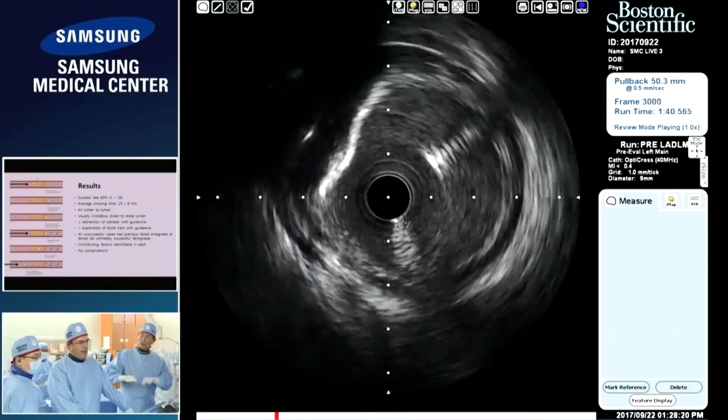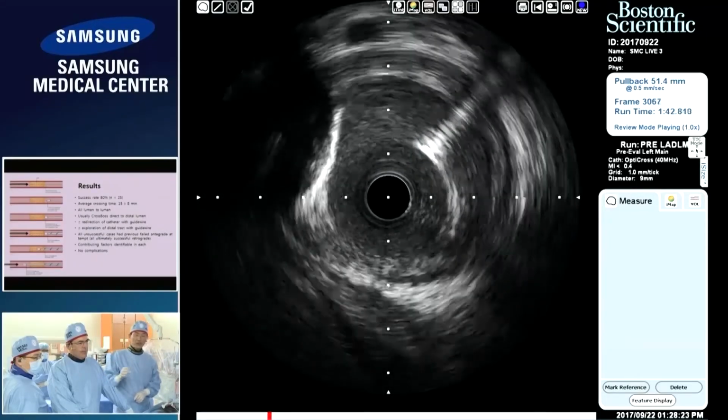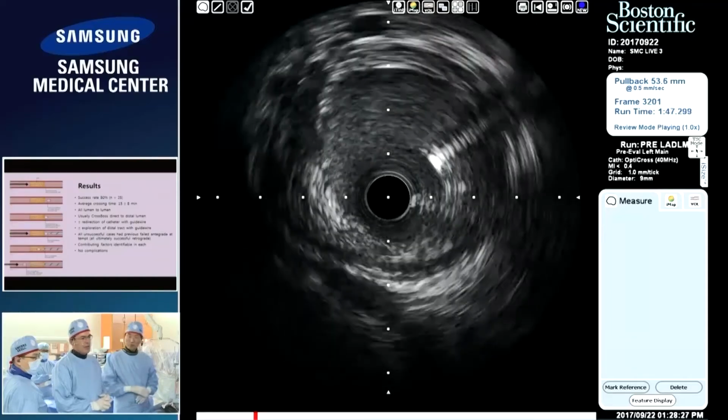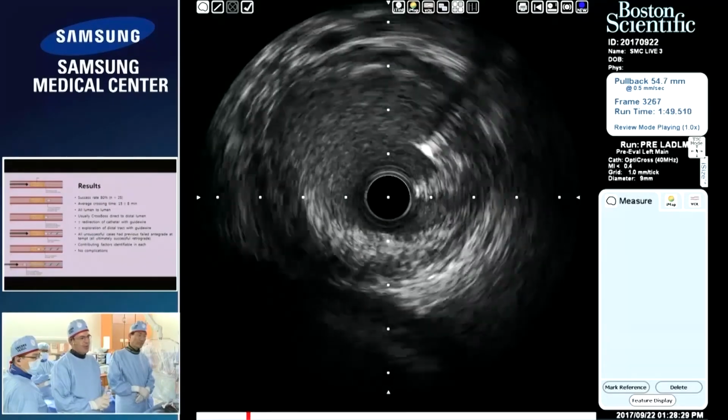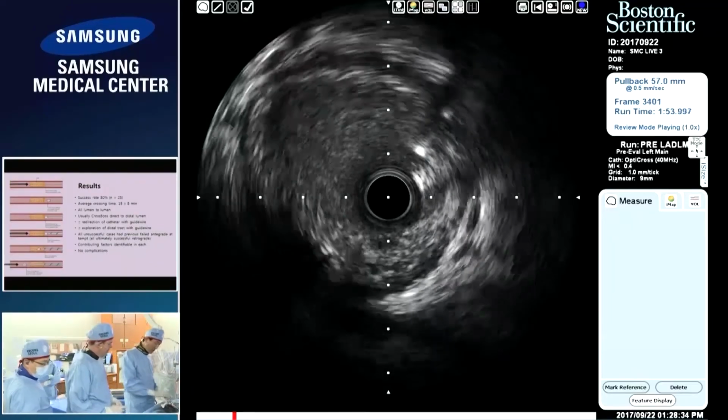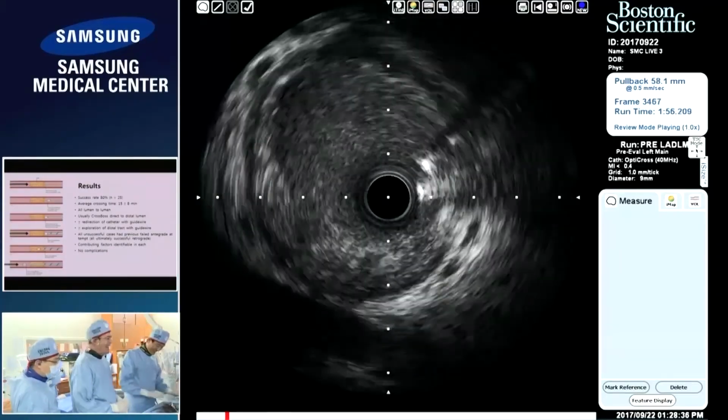There is some discrepancy though, so IVUS measures a little bit larger. But the OCT pictures are good. They're just not as clear practically, but useful as well. Okay, a lot of images and a simple procedure maybe.